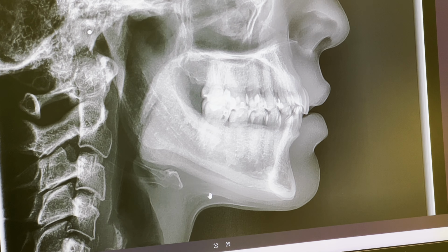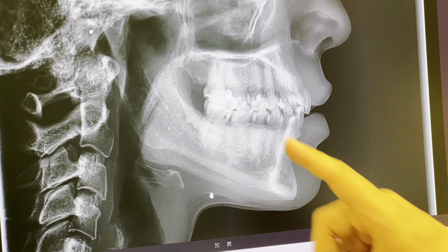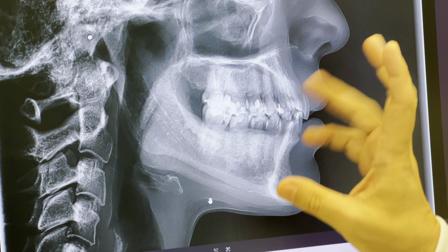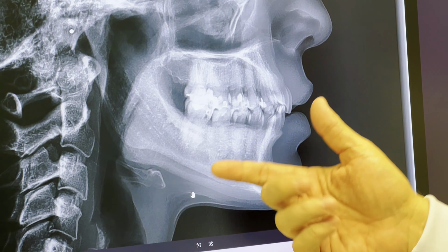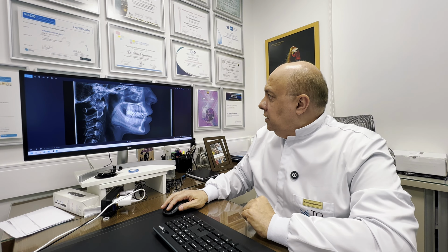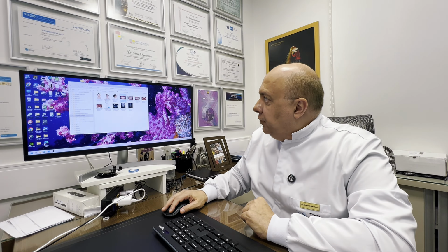What I can see here is that those borders are not matching very well, and you can see two heights on these. This is what you see like a mess. I cannot see clearly the teeth because this side is higher than the other. So this is really a vertical problem. So little by little, we start to understand the patient. We start to see the patient's problem.